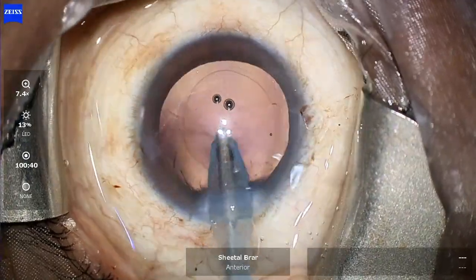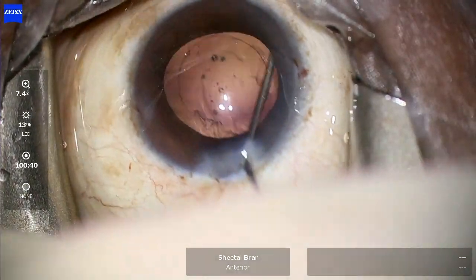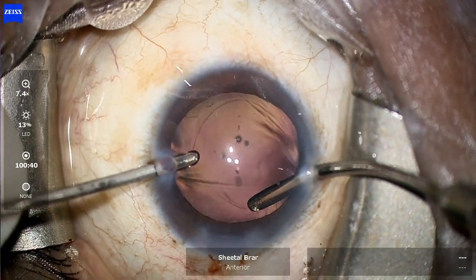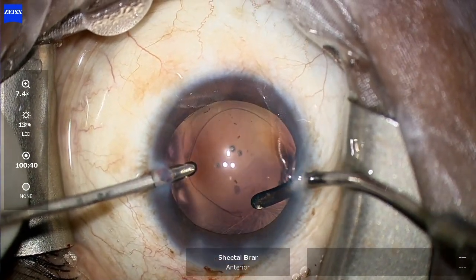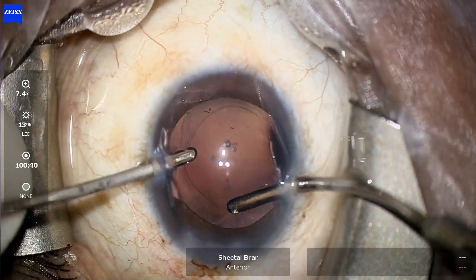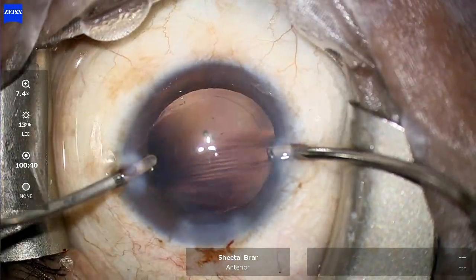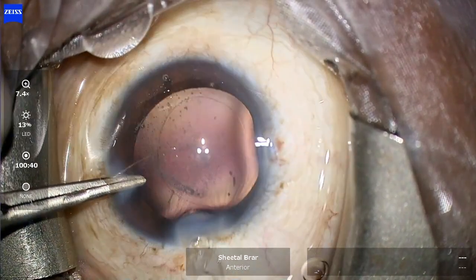I can now go ahead with irrigation and aspiration to remove the OVD from the bag. I also try to do some hydro-polishing of the posterior capsule, then use a bimanual irrigation-aspiration cannula to aspirate some sticky and thin peripheral cortical fibers that have been entrapped under the CTR and are a bit difficult to aspirate. Without fiddling too much with it, I proceed.